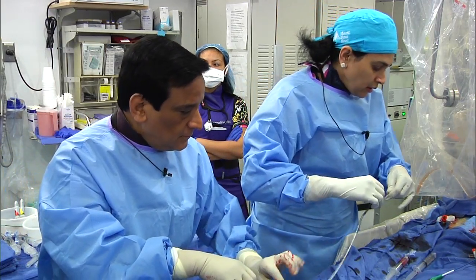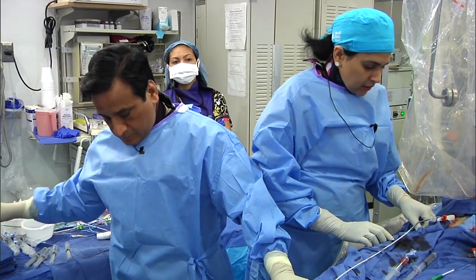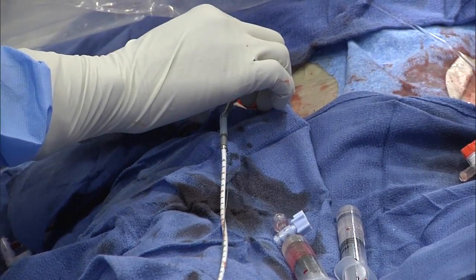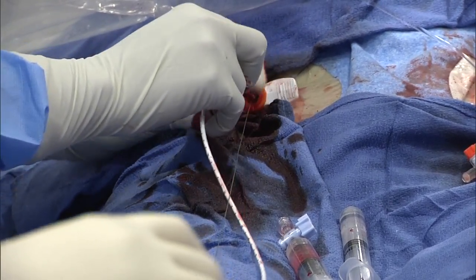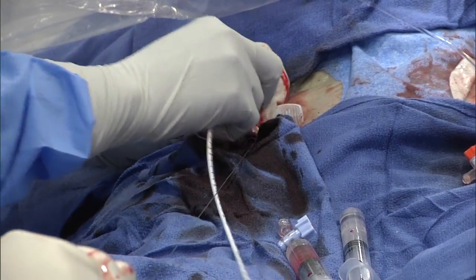So this is a 14 French device? 14 French, yeah. The 14 French, that special sheath, and the device 9 French. Mainly because of the pump which is at this. Now when you're going in, you have to be careful. Again, there will be a lot of bleeding. So if you can go in quick, here it bleeds a lot. Good. And just advance slowly.